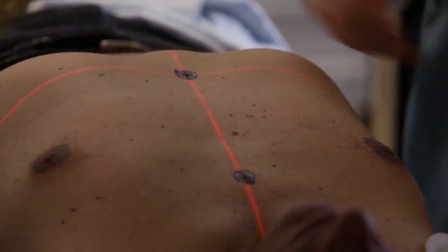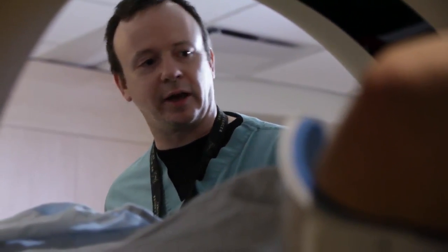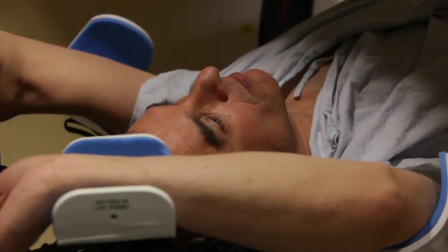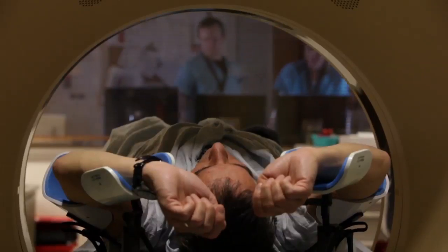We will tell you what we're doing every step of the way. During the CT sim, if there's anything you're unsure about, you can ask. You don't feel anything at all — it's not scary, you're just laying there comfortable and relaxed. The images taken during the scan help us plan the position of your body during treatment and how we can ensure that you will be in the exact same position every time.